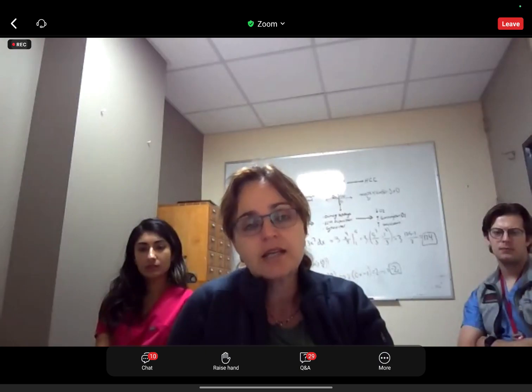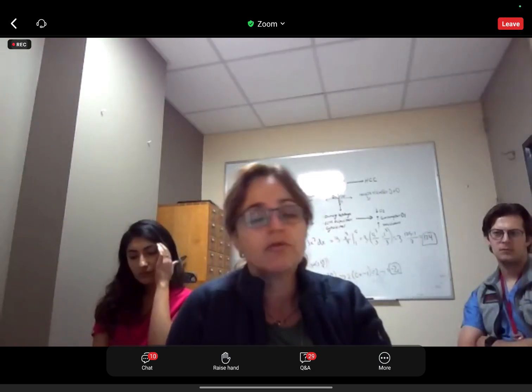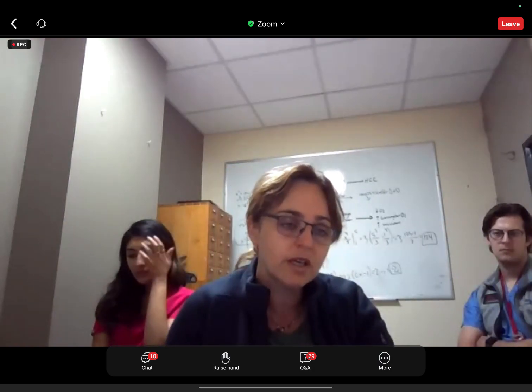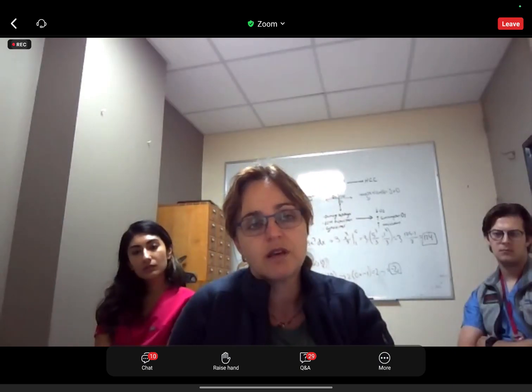That being said, there is no data to say whether our performance is improving. Unfortunately, there's no data on that. I think there are not enough people using spectral CT to drive that kind of research.